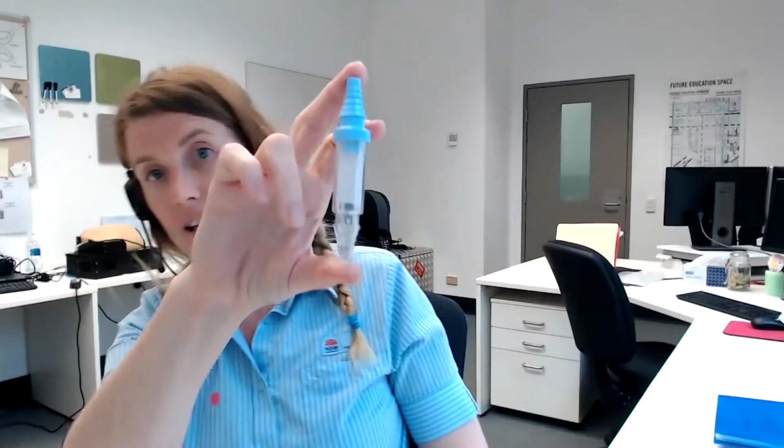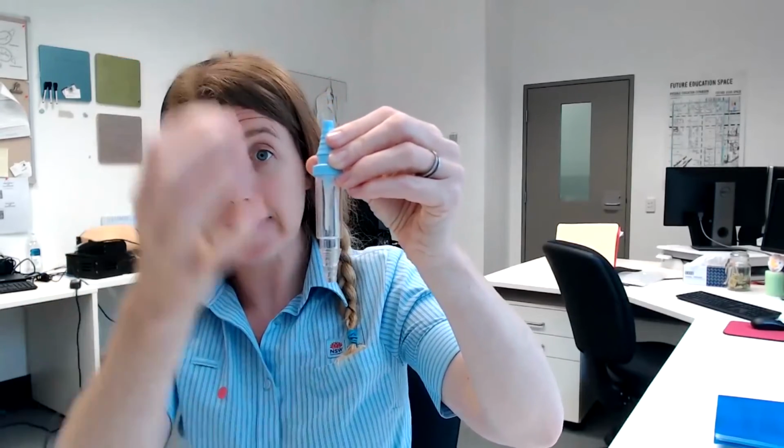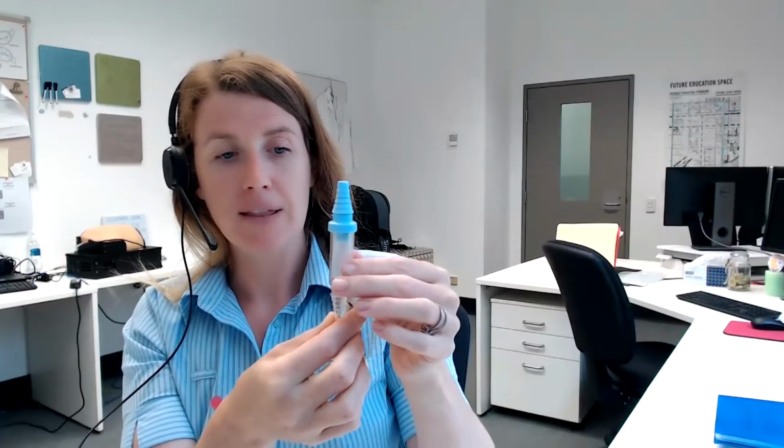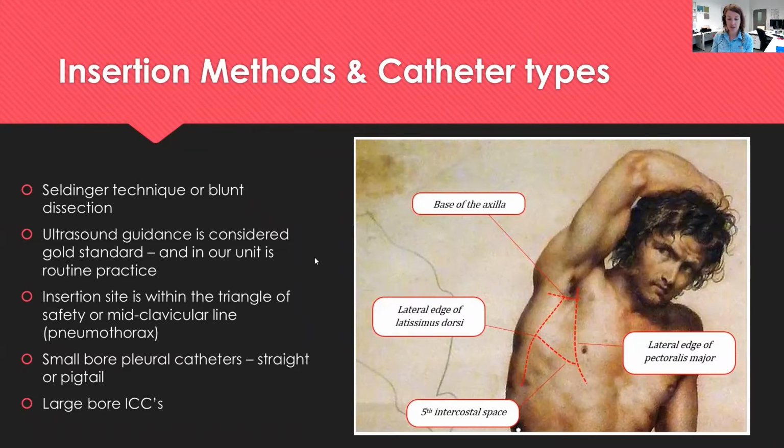The other thing that you might see around are these. So this is like an anti-reflux valve, designed for a chest drain. The flow can only go one way. So flow can come out, things can't go back into the drain, and that's really important. We don't want to put air or fluid back into the patient's pleural cavity. We want to drain it all out. These are great as long as they're inserted in the right way in the system. Just make sure you follow the flow arrow. I don't know if you can see that there on the side, but the arrow shows you the flow of fluid or air. So you just need to make sure that it's being inserted in the appropriate way. So back to our presentation.